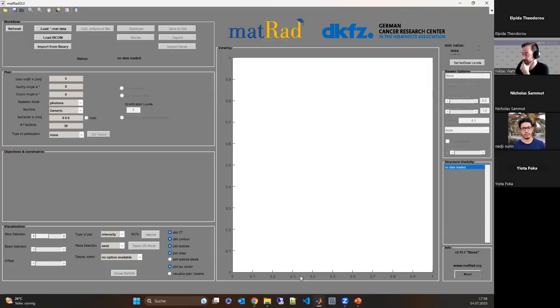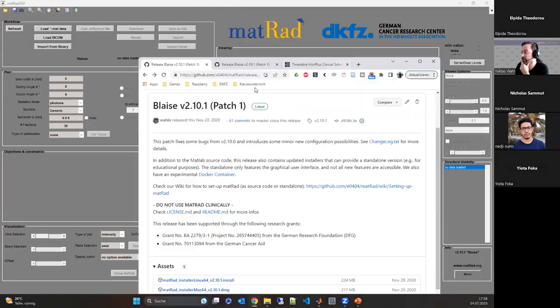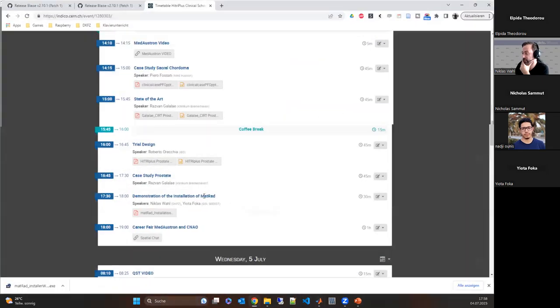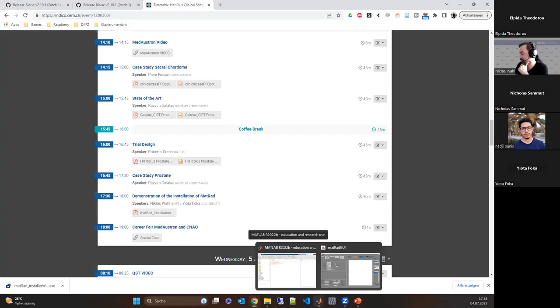As I said, check out this PDF here and try to follow it. I don't see the video panel at the moment. Use the Google Doc; hopefully a link for my question sheet will be sent around, and I will look at it and try to follow it up as soon as possible.